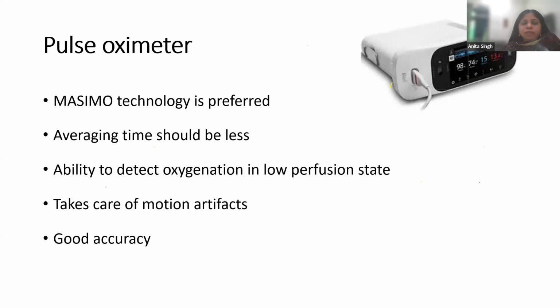And these monitors should also have a good accuracy of around 1 to 2% for the saturation estimation, and the averaging time should be less, and they should be able to detect the oxygenation in low perfusion states and take care of motion artifacts.